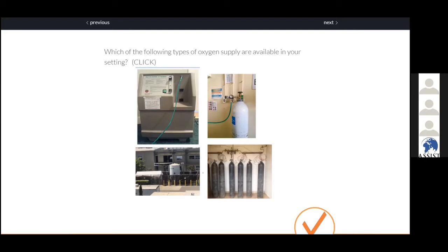In our experience, all those devices are good, but we find that our infection prevention control still needs much effort. As an example, the concentrators have really good advantages, but we found them to be a source of infection. You can ask me why. We are used to changing the mask and plugging it in, like where the green side is, which we see now in the picture. But once we switch the button on and off, many people don't think about cleaning this side. We saw many people doing this while already wearing a mask and then putting this on patients. So it was a source of infection.